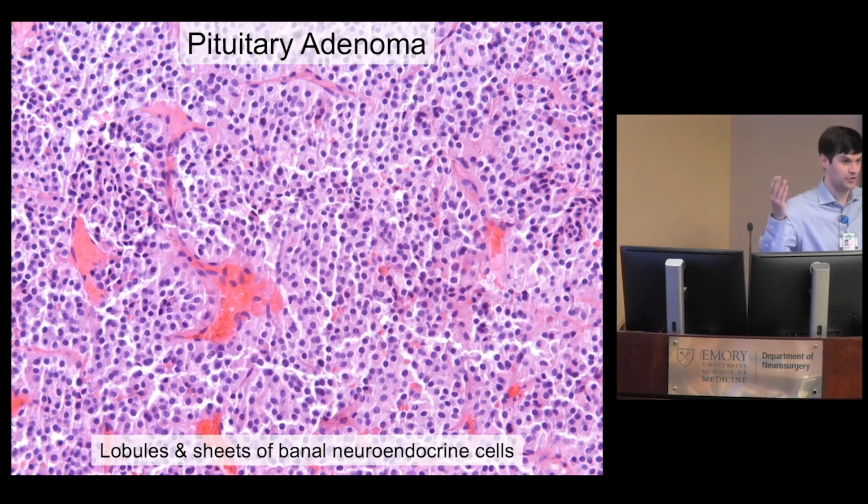So a lot of tumor cells will be positive. But for these adenomas, it wasn't actually associated necessarily with a TP53 mutation. It was mainly just looking at, well, there's a lot of these cells that may or may not have P53 expression, and there was no cutoff given. So it was an observation of elevated P53 expression. And so what you ended up with was different sites, different people would look at a P53 and reach a different conclusion.